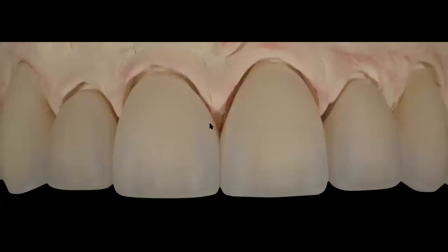You can see that if they add the right staining, white, a little bit of yellow, gray, you are going to get very highly aesthetic restorations with this type of substrate. Now, obviously you have to have a lab technician that has the artistic ability in their hands in order for them to provide you this type of restorations.